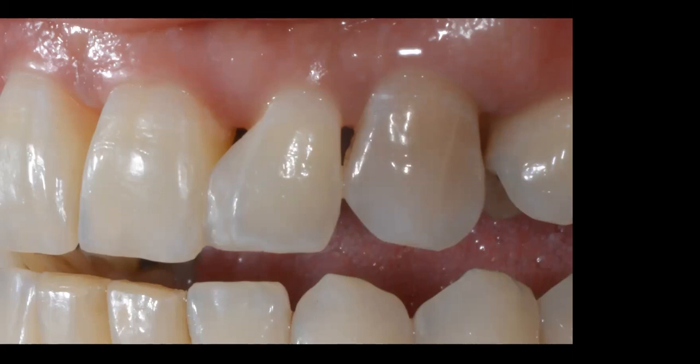So what we're going to be doing now, Dr. Jacob PCS, what are the chances of fracture? Well, if we create a monolithic restoration that is injection overmolded, and if we have the right clearances on the incisal edge, we see very few fractures. But we have quite a few rules for injection overmolding, and one of them is that the incisal edge has to be 2 millimeters thick buccolingually.